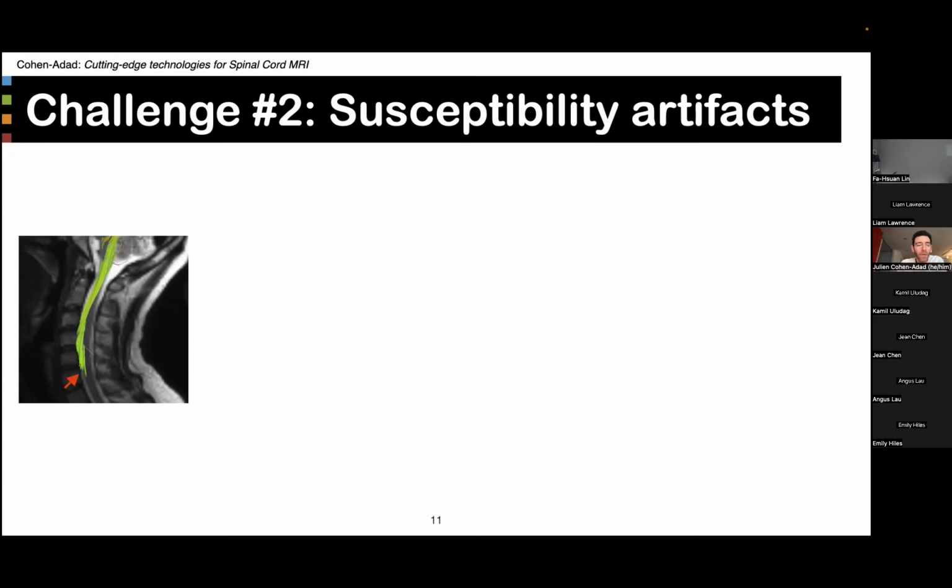And what we seem to observe here is that there seemed to be a complete spinal cord injury at around C6 vertebral level. But in fact, I was the subject. I was scanned a couple of years ago, and this interruption of tracts is only artifactual.